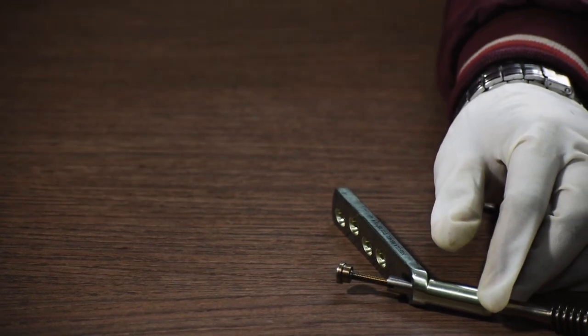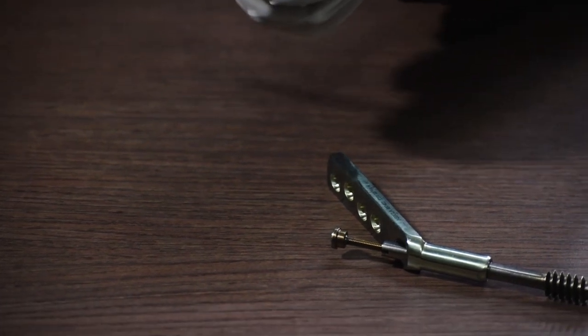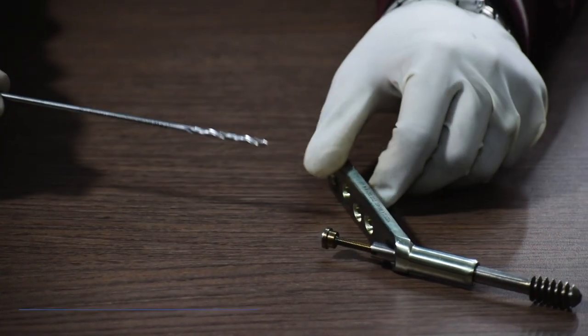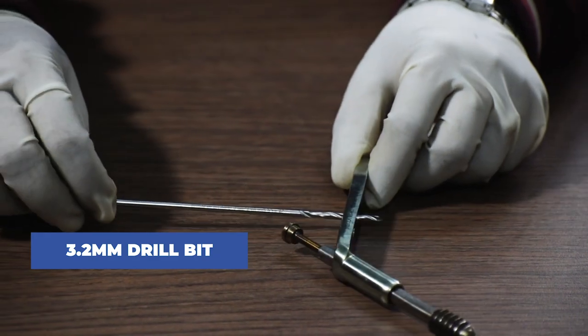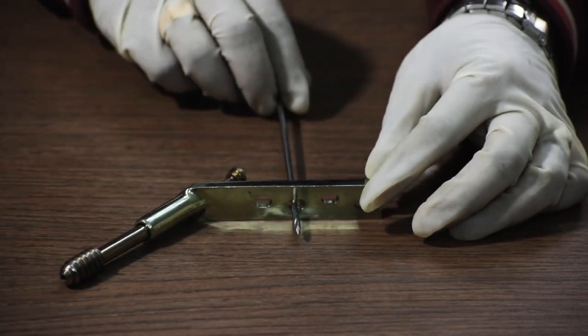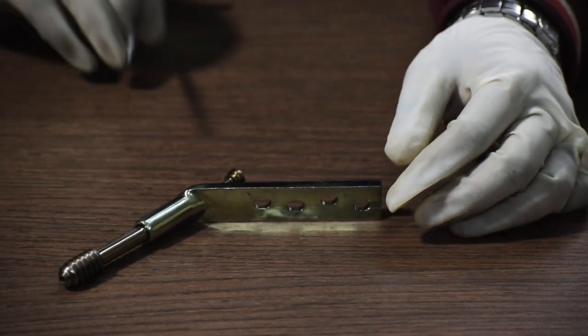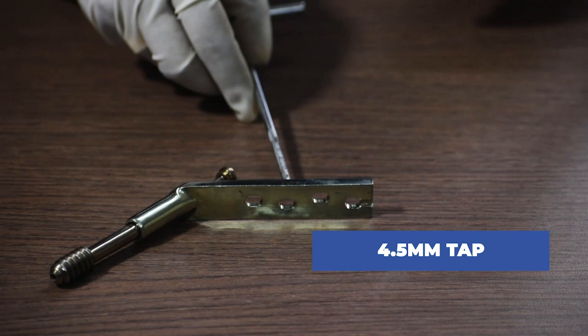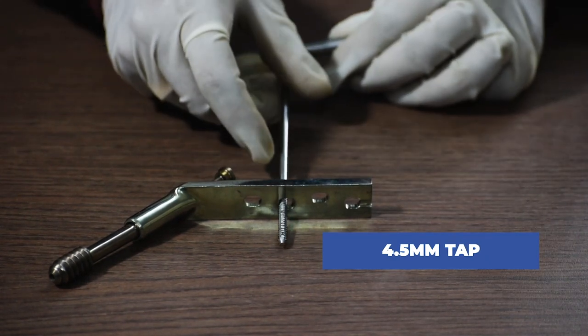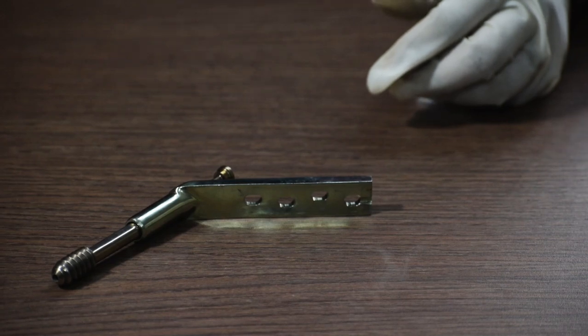After that, for the next step we are going to use a 3.2 mm drill bit to drill through the hole in the shaft region of the plate. And then we will use a 4.5 mm tap to tap through the drilled hole for smoother entry of the screws.